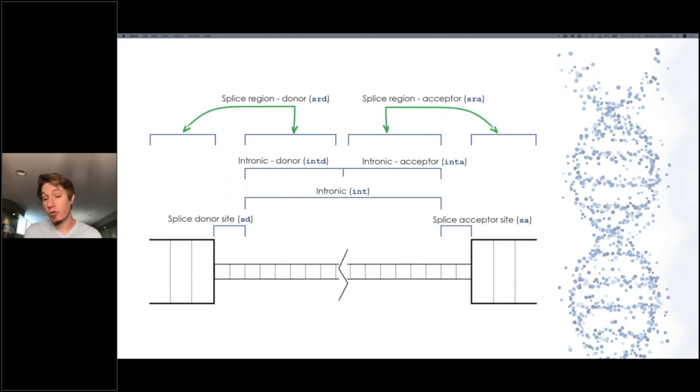But if there happen to be 200 articles, it's much less practical to be able to look through all of those and see if any of them are more relevant than others. And so one of the things that we've done recently is we've subdivided the intronic variants in order to give the option for more specific groupings of relevant variants. So for example, if you search for something in the splice region on the donor side, we can show you other variants in the evidence in the medical literature from that same splice region, meaning it might have a very similar or highly related biological effect to the variant that you're searching, even if it's not exactly your variant.